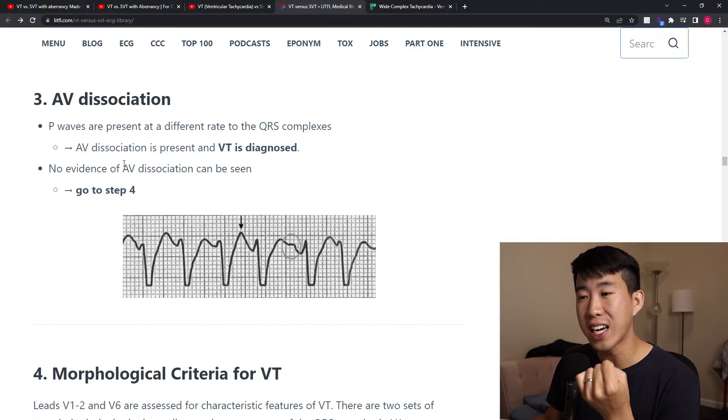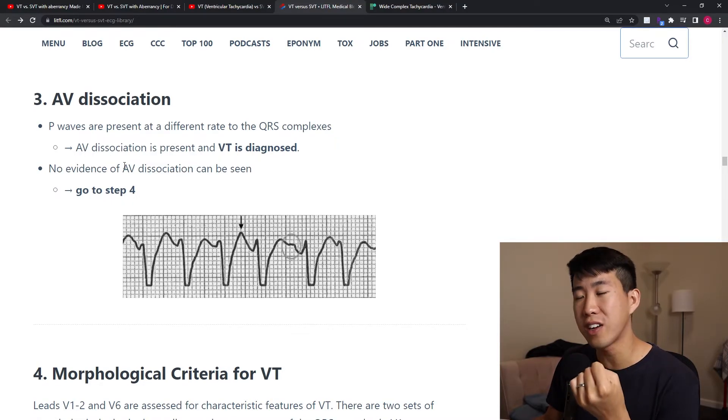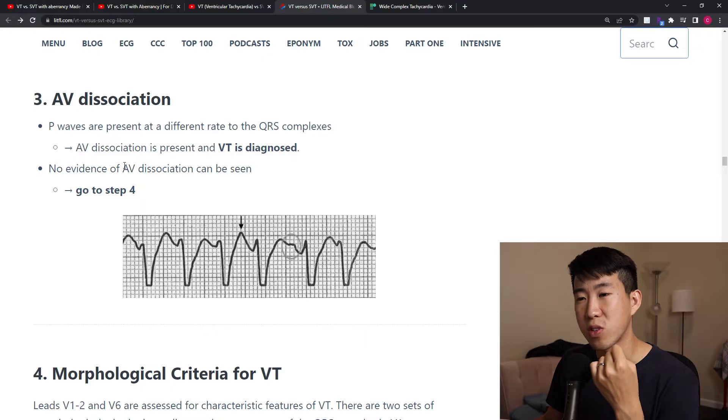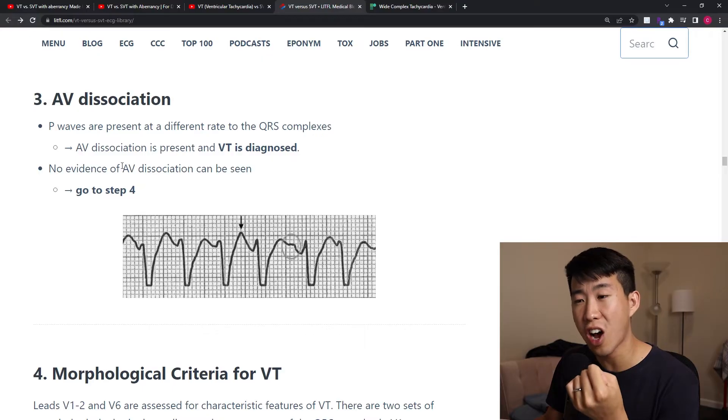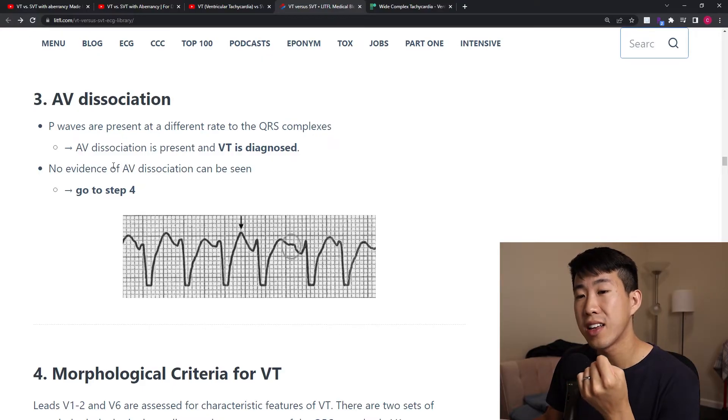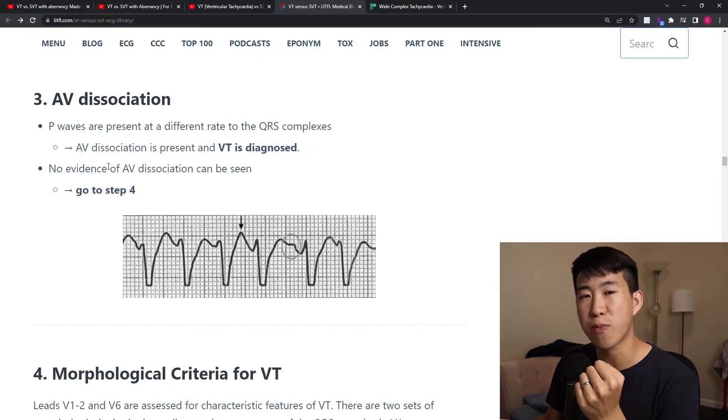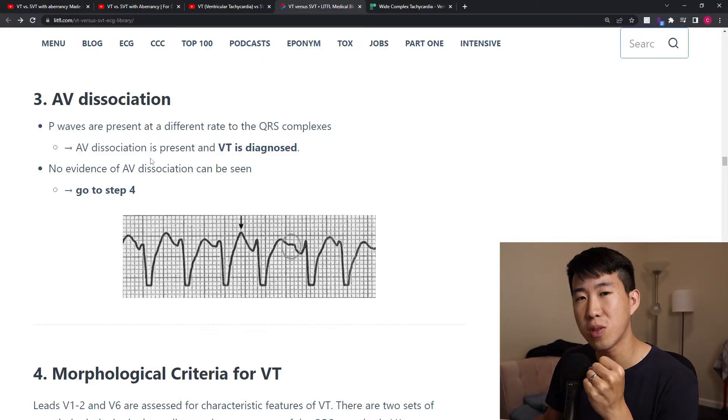If none of these are positive — no concordance, RS interval under 100 ms, and no AV dissociation — then we go to step four, which is a bit more involved: assessing morphological criteria for VT.